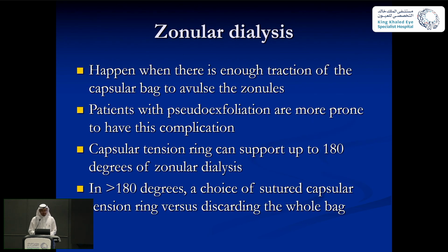Zonular dialysis. Zonular dialysis happens when there is enough traction of the capsular bag to avulse the zonules, and it happens in patients with pseudoexfoliation, who are more prone to have this complication.